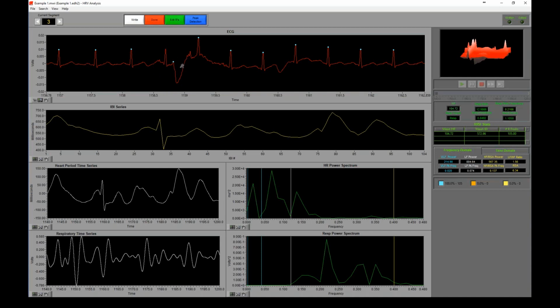And so in this situation, if we would have just been looking at blue peaks and we weren't looking at abnormal signal morphology at all, we might have missed this. It's likely that it doesn't have a substantial statistical impact in this scenario, but it's always better to correct these things when they do happen. And so in this situation, we want to open our editor and make that change.